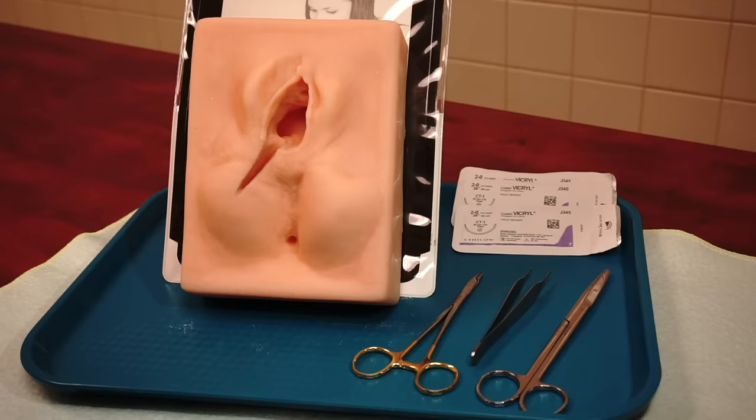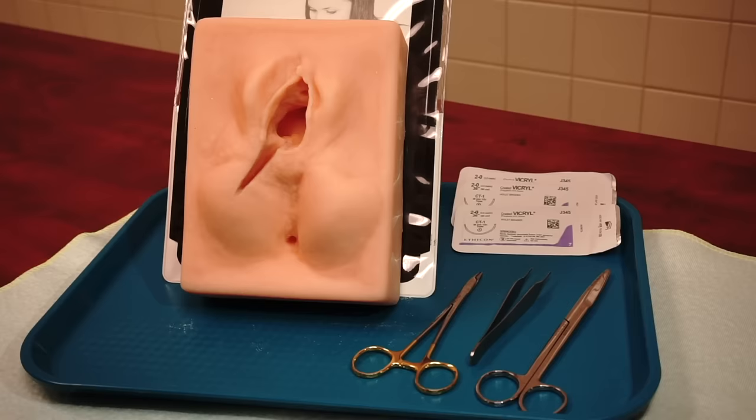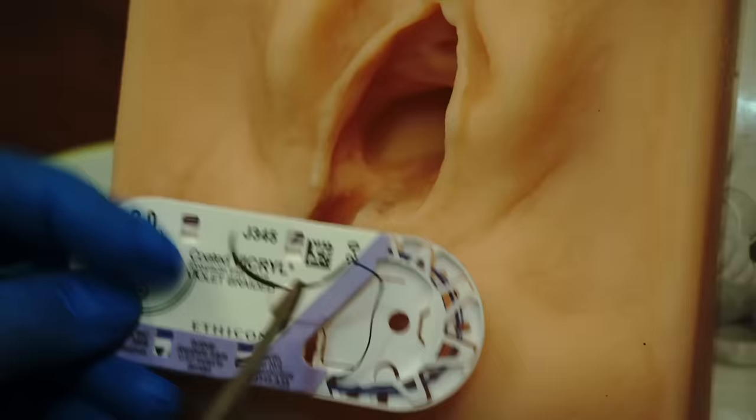So now we're ready to start the perineal repair. Here we have the pelvic model with the right medial lateral episiotomy. We have on our tray the needle driver, tooth pickups, straight scissors, and suture material of your choice. My preference is to use 2-0 or 3-0 Vicryl and that's what I will be using today during the repair.